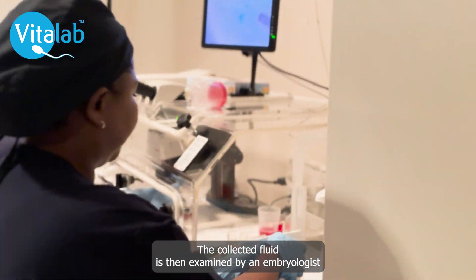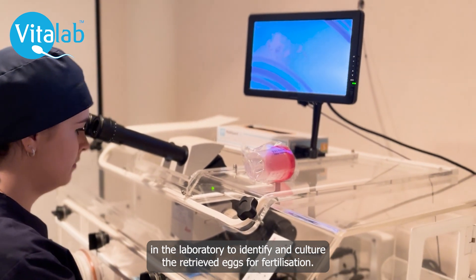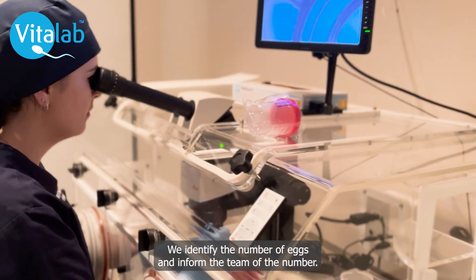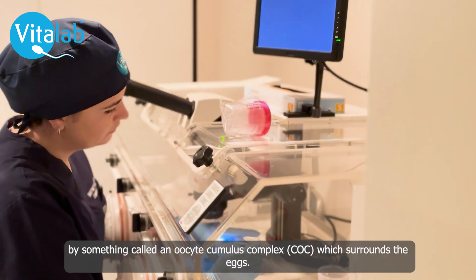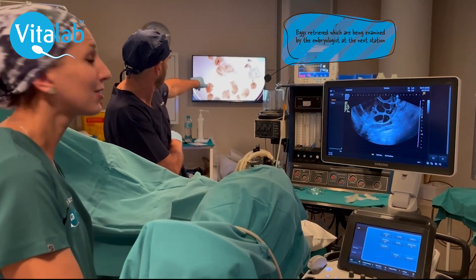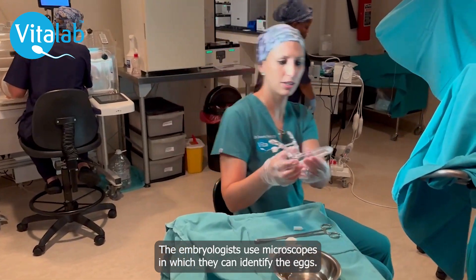The collected fluid is then examined by embryologists in the laboratory to identify and culture the retrieved eggs for fertilization. We identify the number of eggs and inform the team as the procedure concludes. The eggs are identified by something called an oocyte cumulus complex which surrounds the eggs. Embryologists use microscopes to identify them.